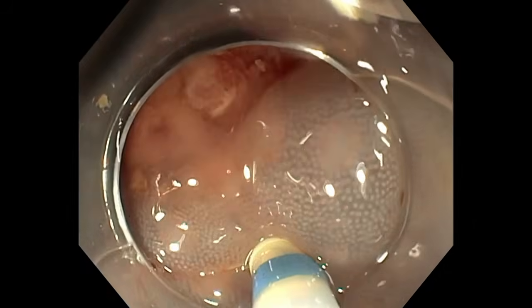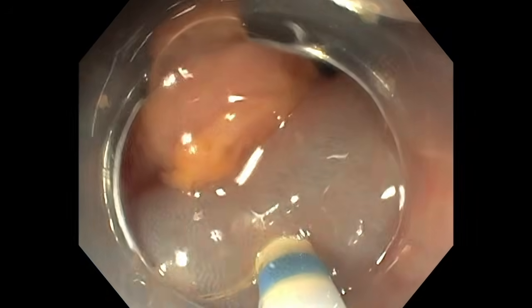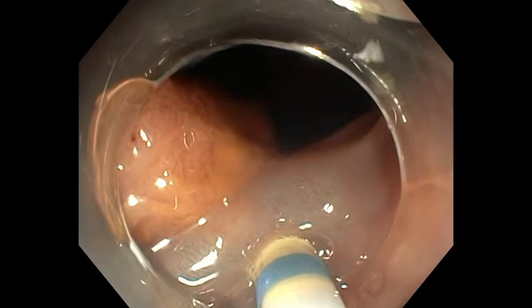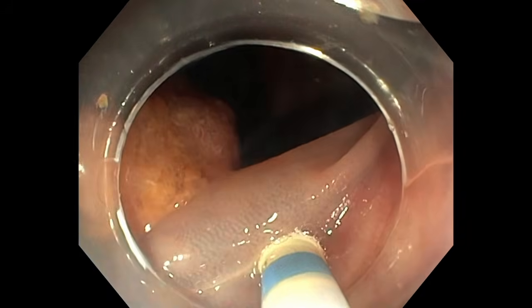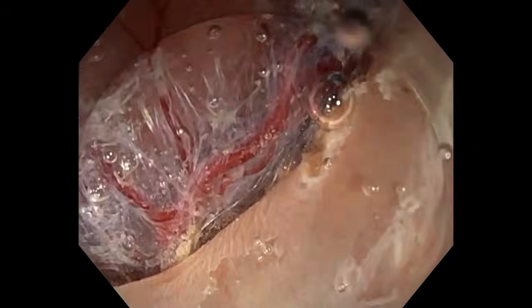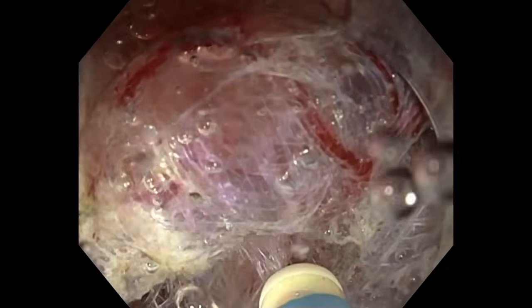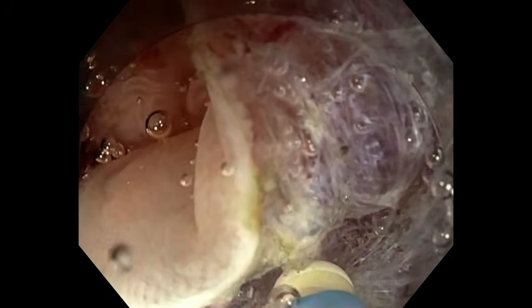So my strategy is to inject a lot. So I will do a very large incision relatively far from the lesion. If possible, I try to do it not in the slope, not in the heel, but more on the flat area, so entering under the lesion is easier.